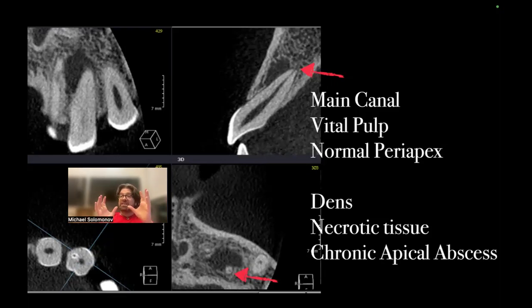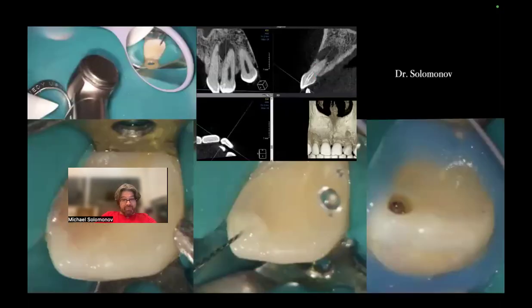And because we have this type of diagnosis, we can choose a very nice approach, the selective root canal approach. Firstly, by the way, described in the literature in 1987 by my teacher from Tel Aviv University, Professor Ariel Kaufman. This is what I did, okay?